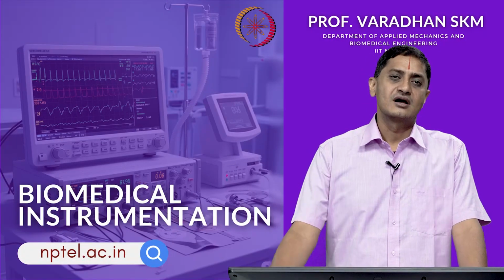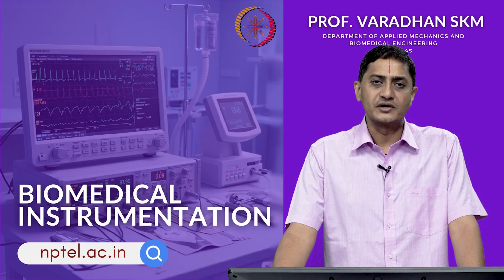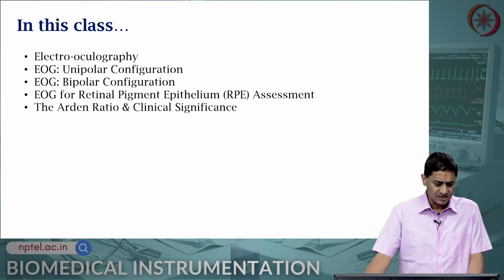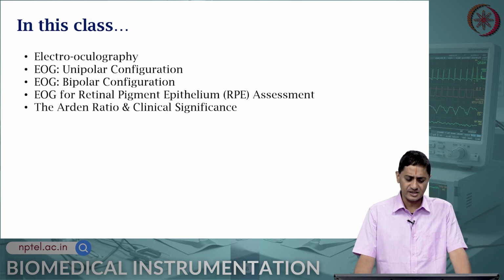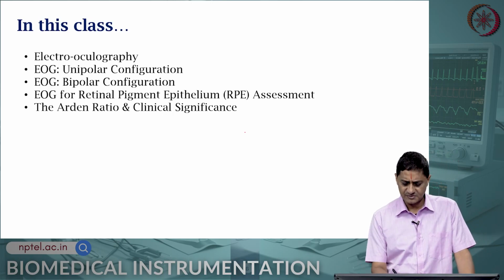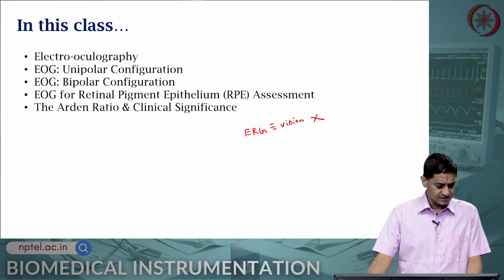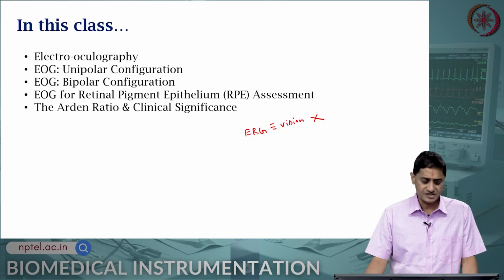Welcome to this course on biomedical instrumentation. We were looking at electroretinogram. Let us discuss some of the common beliefs or common student misconceptions, some of the ideas that students may not completely understand regarding the electroretinogram. First, sometimes students think that ERG essentially measures vision. This is not true. ERG is essentially a measure of retinal function, not vision itself.